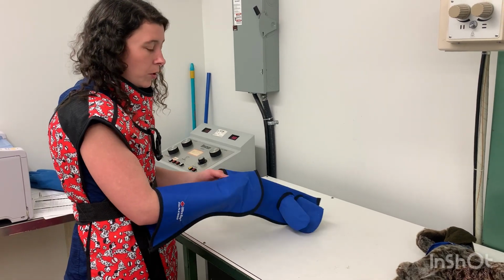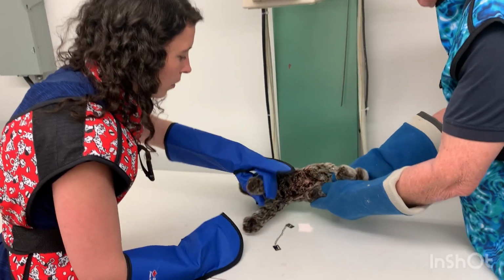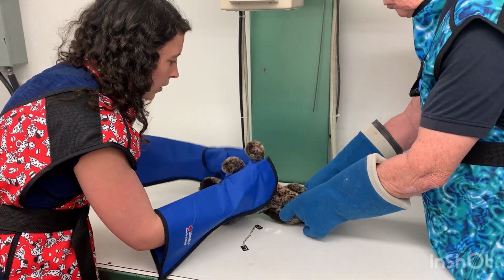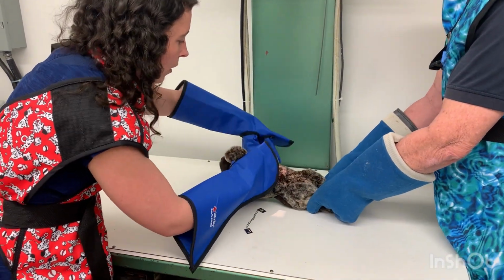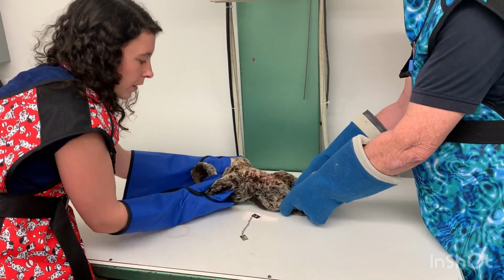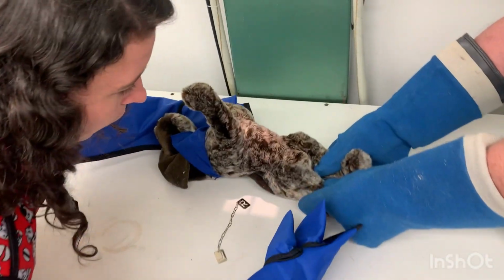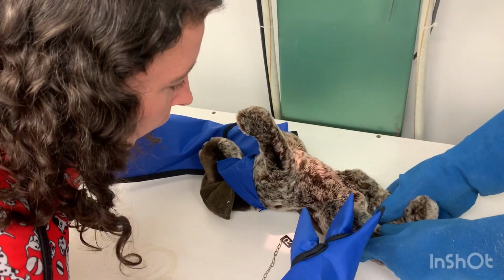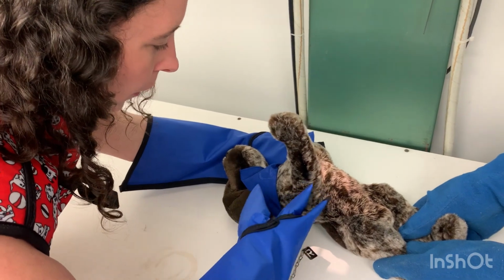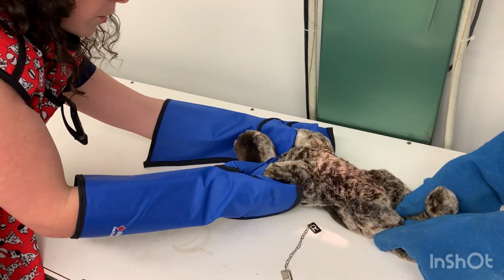We're ready to go, so we're just going to reposition our patient here. We're going to be turning our patient into a ventral dorsal position. So you take the back legs and you're going to need to extend them back. Now I'm going to make sure I'm holding onto the sides of the head here, and we're going to look at our collimation again. We want to make sure our collimation field goes to about here and about here. So we're getting from the 8th rib all the way to the greater trochanters again.